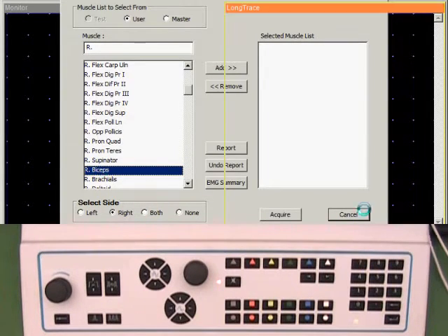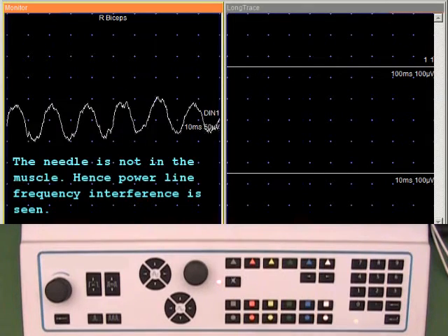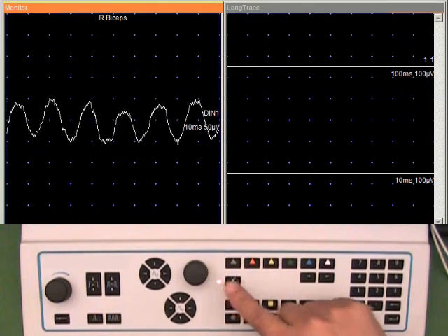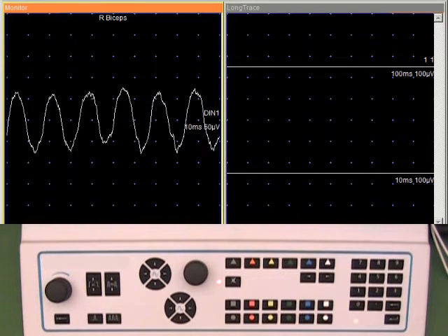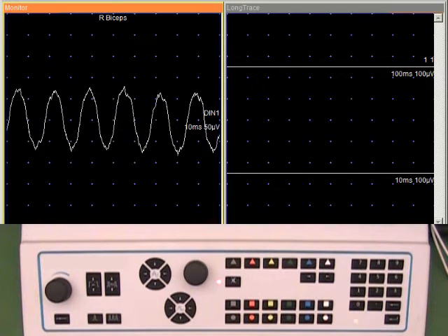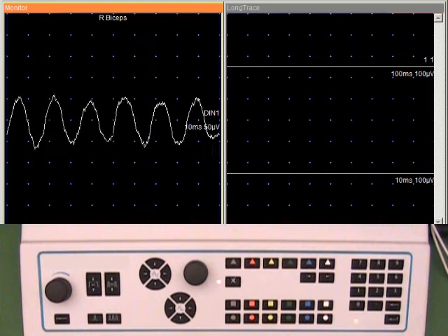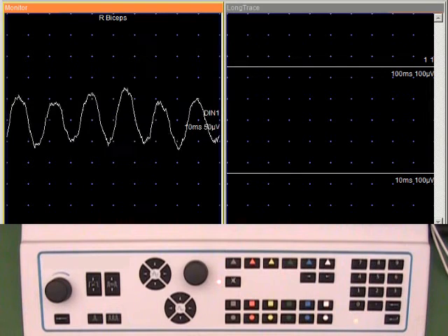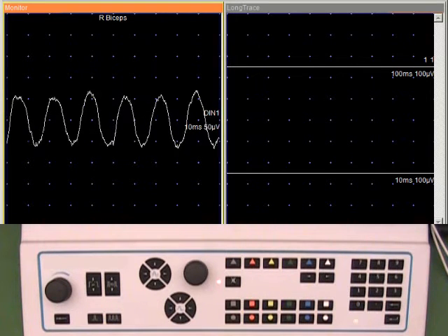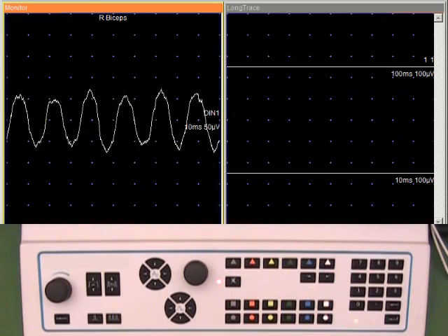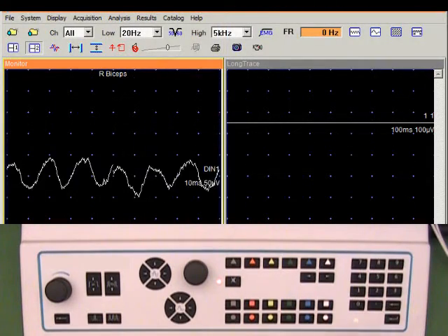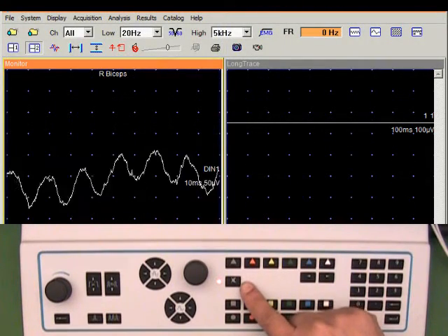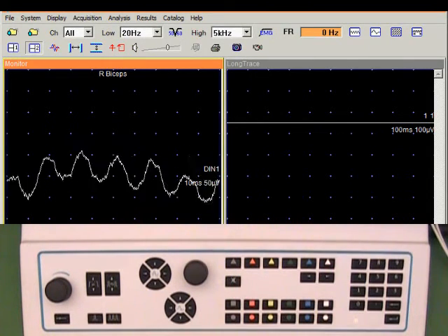Notice that the speaker has been muted. One of the settings in the software is to mute the audio when we are not recording any signal, so it will not produce any loud disturbing sounds to the patients when the needle is not inside the tested muscle.